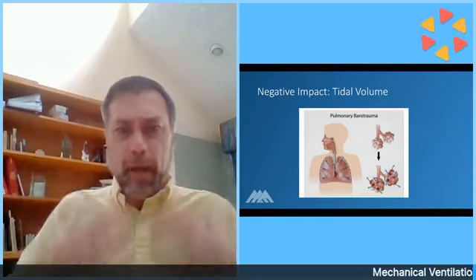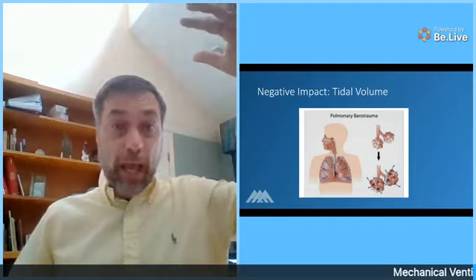So let's advance the slide for a moment. So it should be obvious then how we use tidal volumes. Tidal volumes are simply the amount of air that we breathe in. The more you breathe in, the more you breathe out. The more you breathe out, the more CO2 comes out. So I can use your tidal volumes to increase or decrease CO2. If CO2 is low, I can turn down the tidal volume. If CO2 is high, I'll turn up the tidal volume. But then my patient can breathe different amounts.